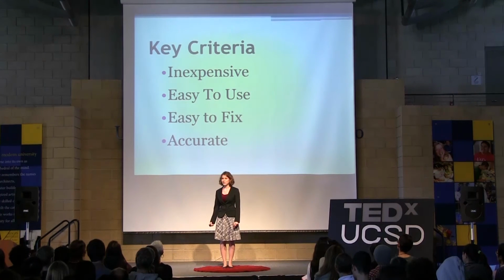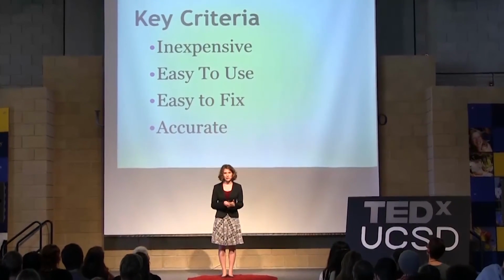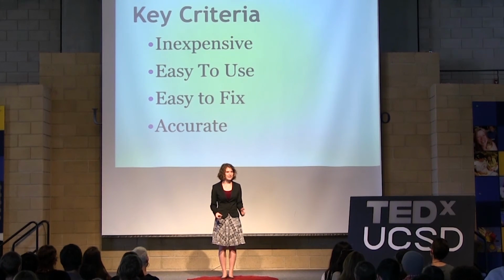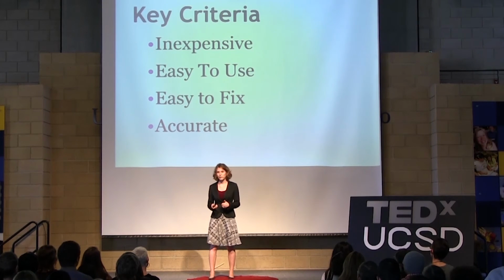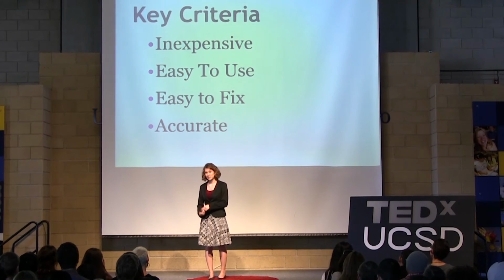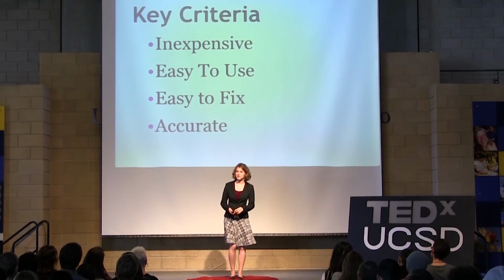If you can recall what I mentioned before, the polymerase chain reaction amplifies a gene specific to HIV in our diagnostic device. But you can have the polymerase chain reaction easily detect and amplify a gene specific to a different disease, and that'll create the diagnostic device to detect this different disease. So this is very easily adapted, and we're excited to move forward and try to use it for diseases other than HIV. We're moving forward at a very fast pace, and we're excited to see how our device will affect HIV monitoring in the developing world.